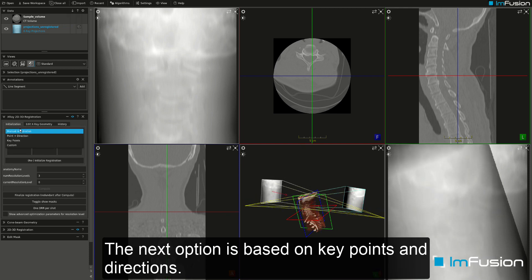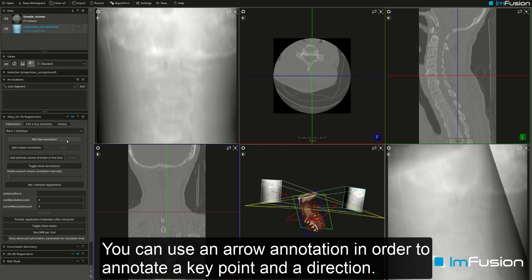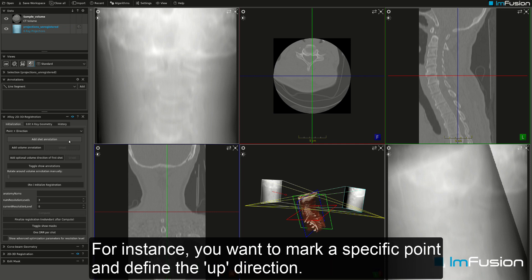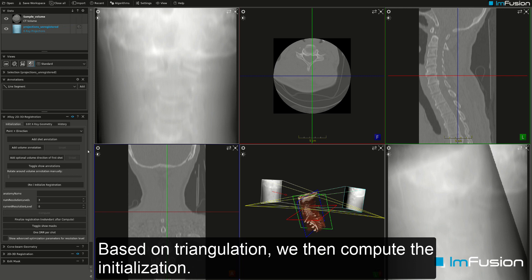The next option is based on key points and directions. You can use an arrow annotation to annotate a key point and a direction — for instance, marking a specific point and defining the up direction. You do this in all shots and in the CT, and based on triangulation the initialization is then computed.